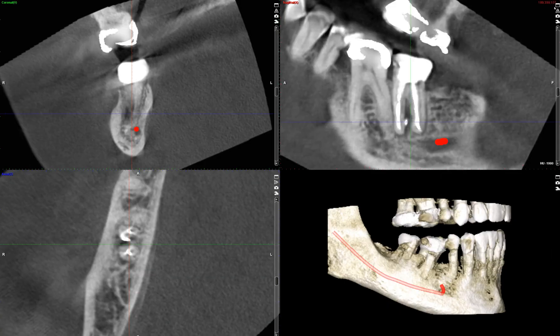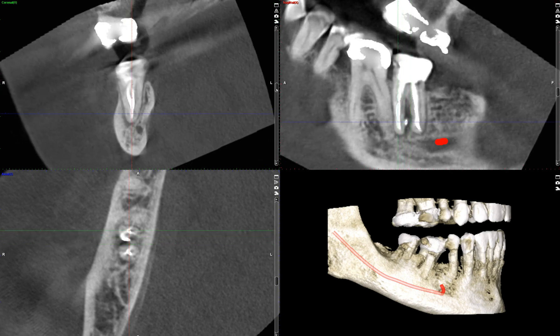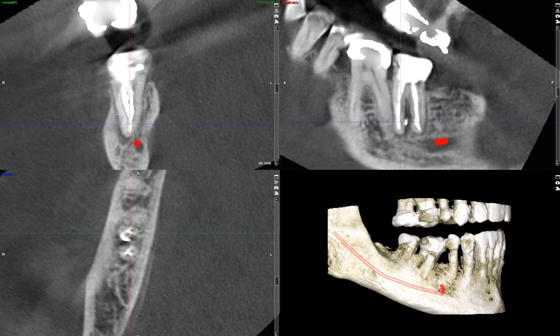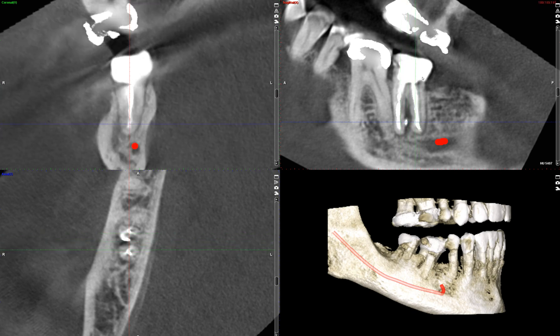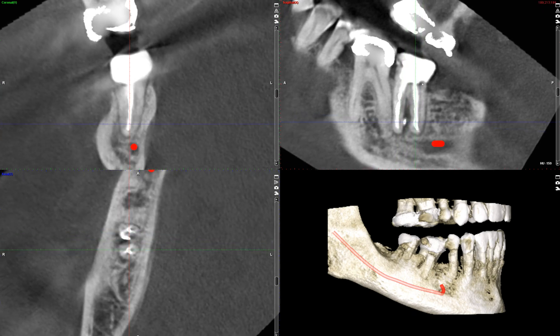Last but not least, let's take a look at the coronal view. Here you're seeing the coronal section through the mesial root, demonstrating how these two canals come together and exit at the apex through a single foramen. And moving to the distal root, you can clearly visualize a single canal filled with filling material that extends to just a little bit short of the apex.